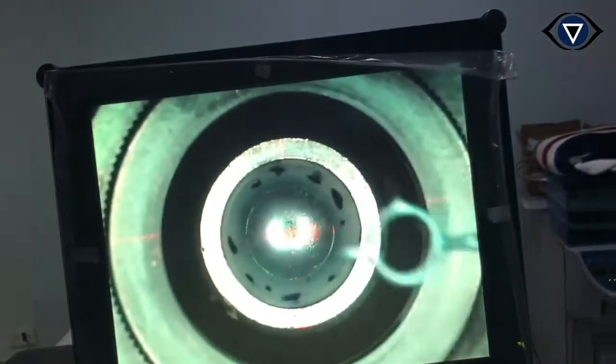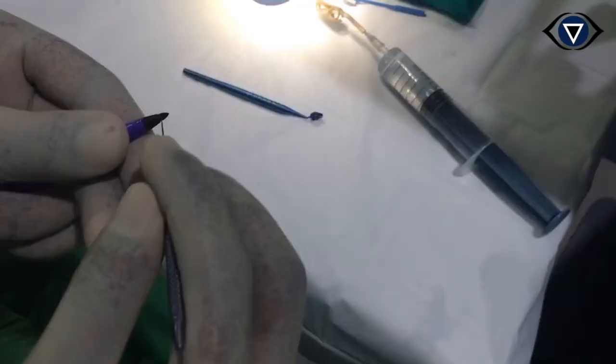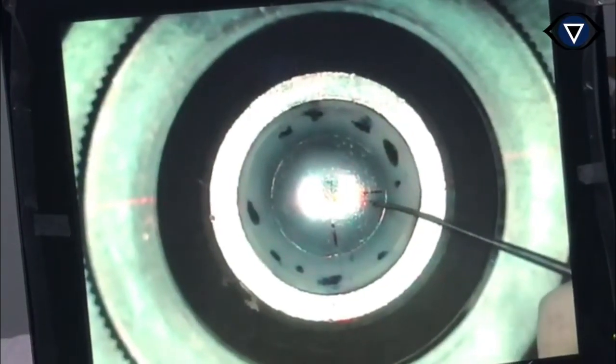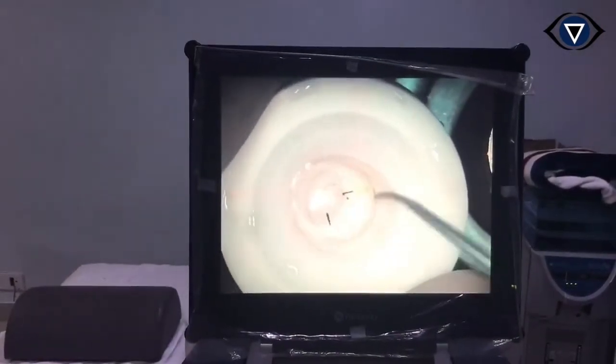Then the marking was done at 9 and 12 o'clock in the inlay to ensure correct placement in the stromal pocket of the patient. Then the lenticule was preserved in BSS.